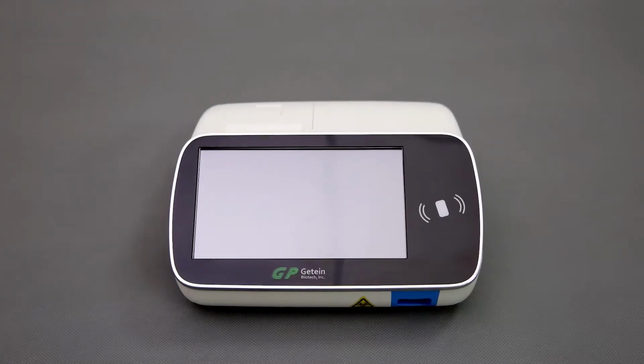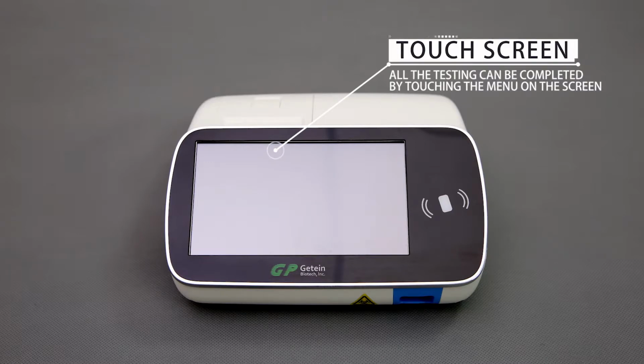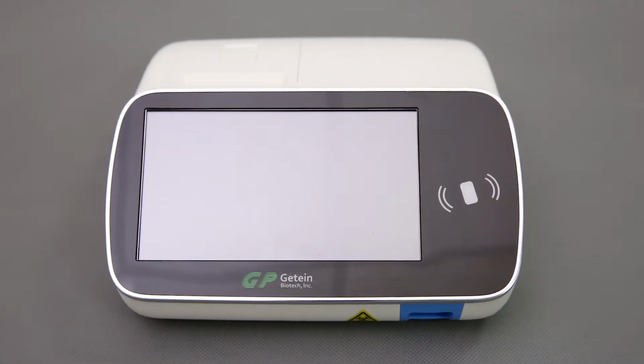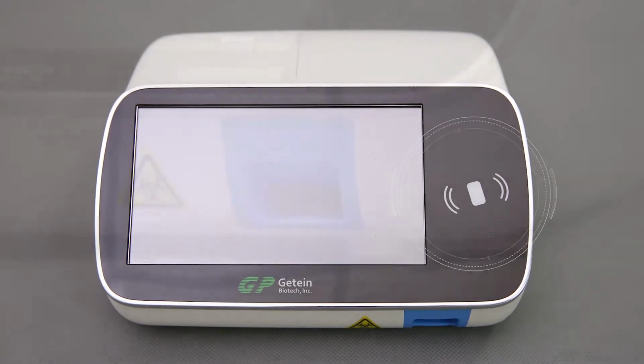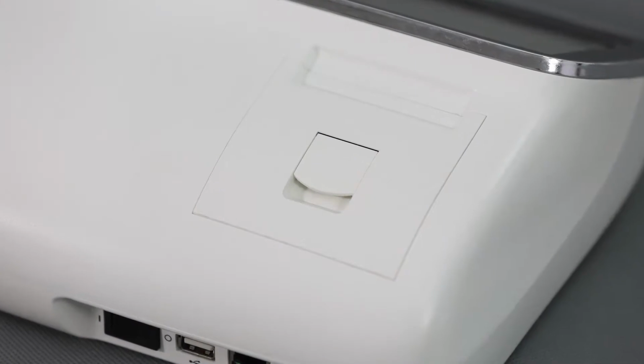Let's learn about FIA8600. All the testing can be completed by touching the menu on the screen. When operating FIA8600, you also need to use the RFID card sensing area, testing slot, and inbuilt printer.